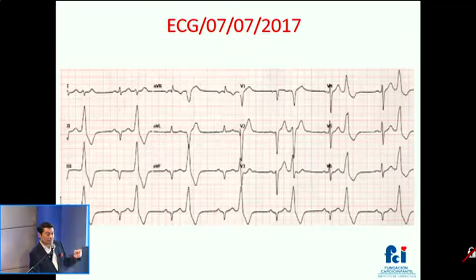We know that that's essential, particularly when we want to differentiate extrasystole from the right cusp or the outflow tract of the right ventricle. So it's very important for you to keep in mind that point, because the comparison of what transitions first in this type of morphology, whether the extrasystole transitions first at the sinus or vice versa, could indicate in a way where the extrasystole comes from. So please keep this morphology in mind.